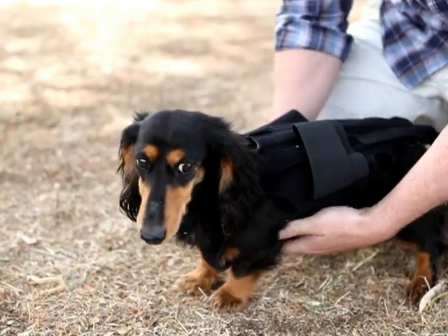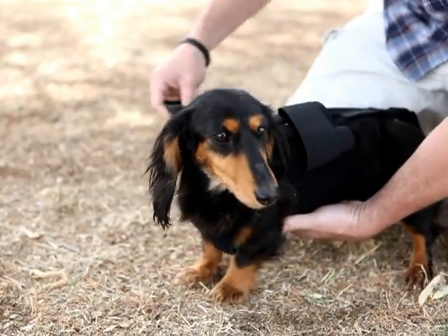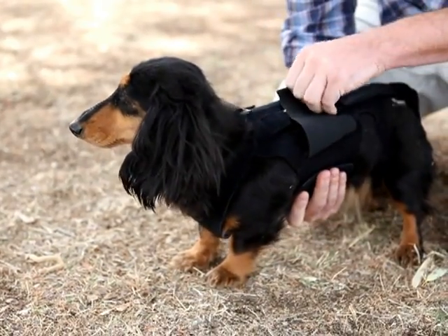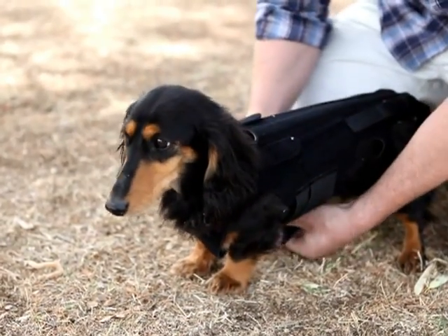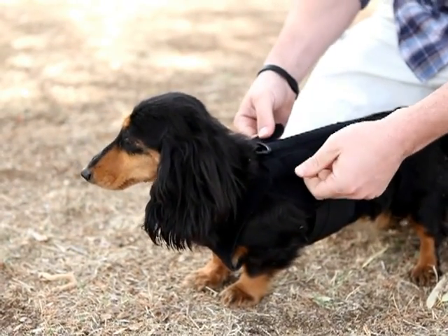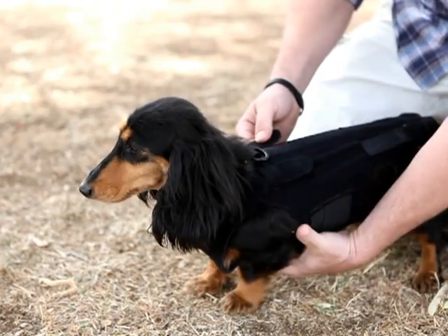Good girl. Now we're just going to take the body, velcro the first piece, and then the second piece and make it nice and snug so it gives a lot of support. We can adjust by using the front straps for the chest girth.